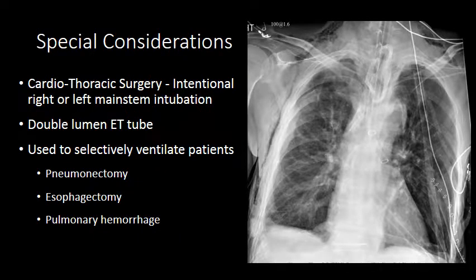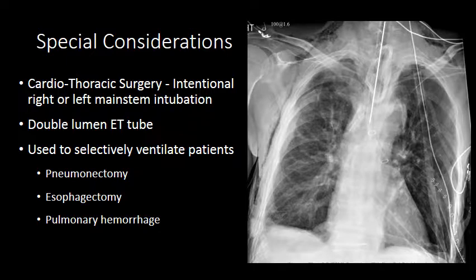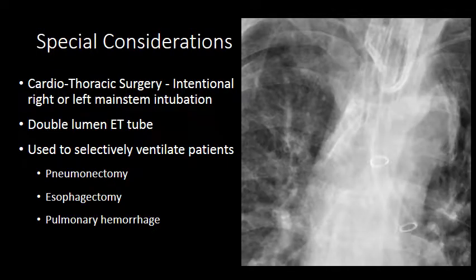There are certain instances in which we want to selectively intubate the right or left lung, as opposed to the trachea. This commonly occurs during cardiothoracic surgery and often employs a double lumen endotracheal tube that allows for selective intubation and ventilation of the right or left mainstem bronchus. In this case, we see the white line of the endotracheal tube with additional structure headed down the left mainstem. Zooming in, we see two rings demarcating the dual lumen of the tube coursing into the left mainstem bronchus.